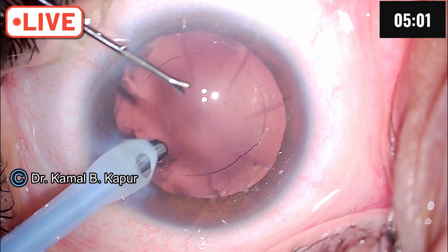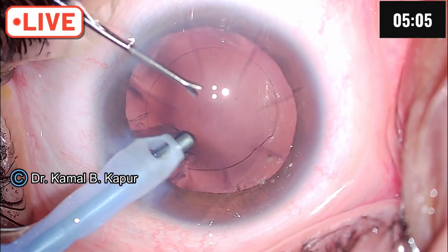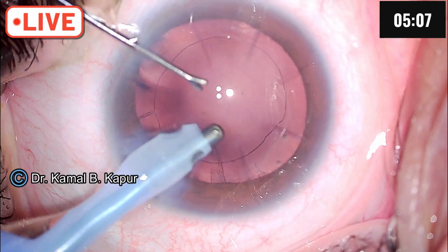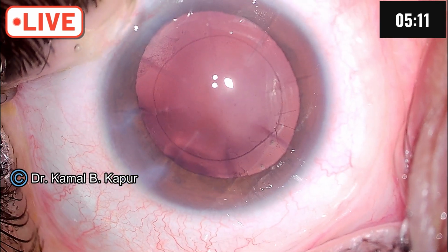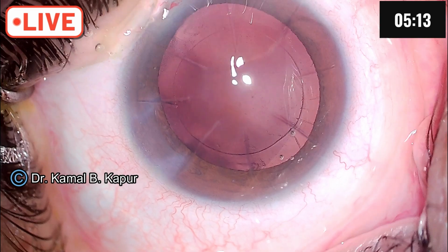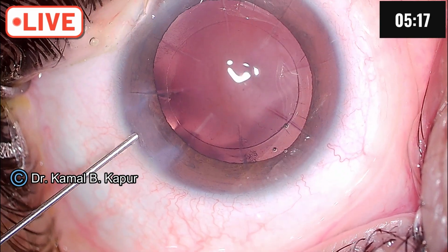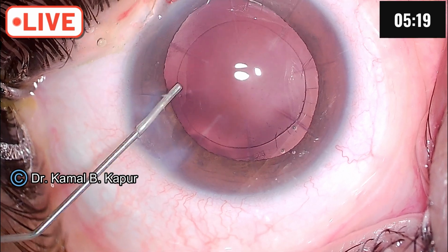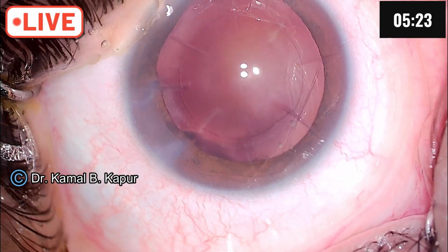It's always a good idea to plan your toric lens in case of post-RK patients only if the posterior float and the total corneal power are also available to you. Otherwise, sometimes we can land up with a cross astigmatism or a compound astigmatism. So we polish the posterior capsule and there we are.